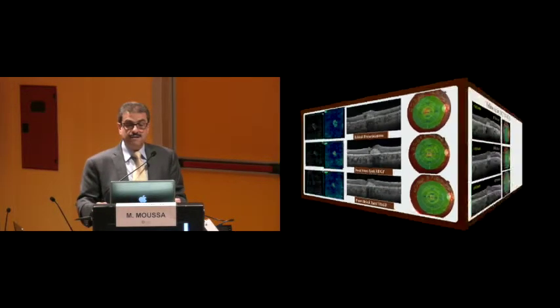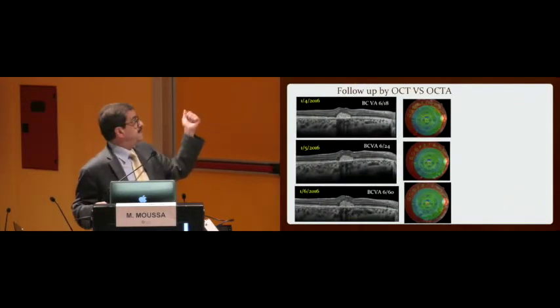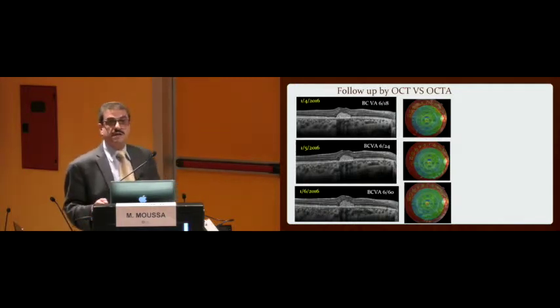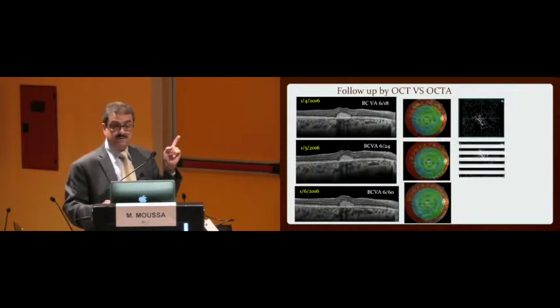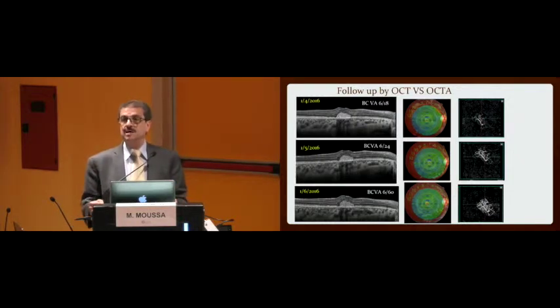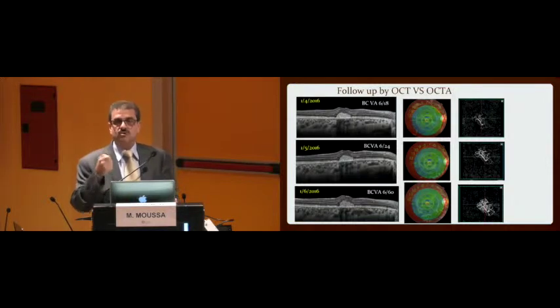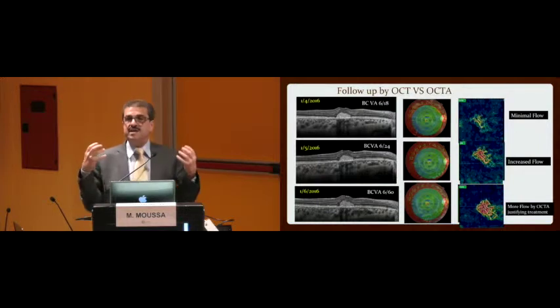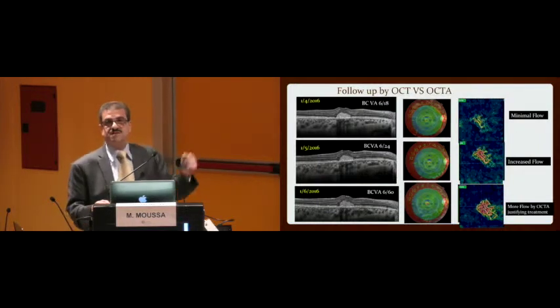So I was following her up, and look at this. April 1st, and then May 1st, and then June 1st, 3 consecutive months. There is nothing in the OCT, minimal changes in the macular map analysis, but look at the OCT angio. This is at April 1st, this is May 1st, and this is again 3 months later. So it means that I have to follow her up by OCT angio, and I cannot count on regular structural OCT. And look at the flow. The flow is increasing, the membrane is getting back again, and I should have injected after the second one.